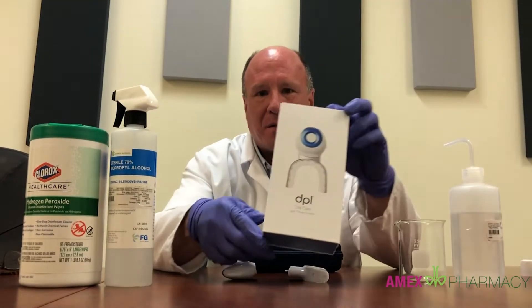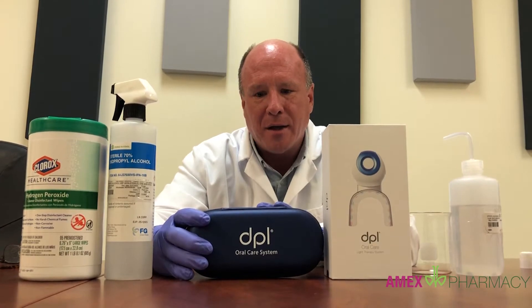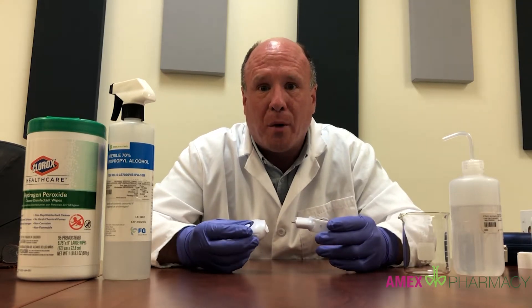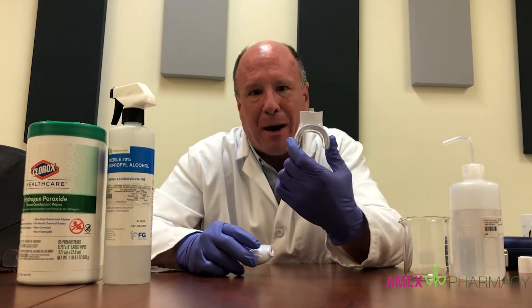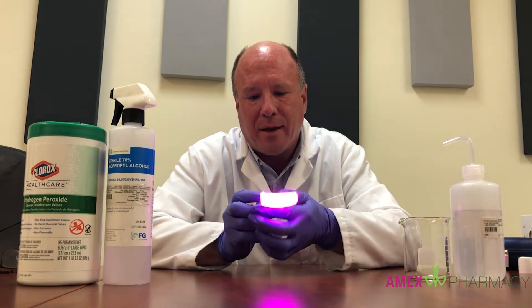The device comes in this package and in this carrying case. What we have here is the device and several ways to clean it. This is your battery pack — the small round piece — and this is the mouthpiece that you put in your mouth. When it's assembled, it looks like this.